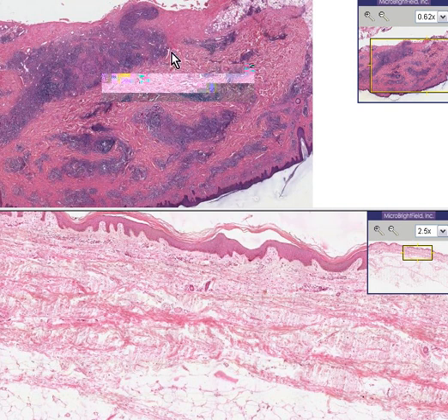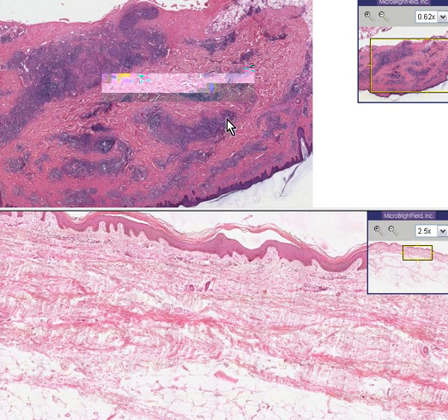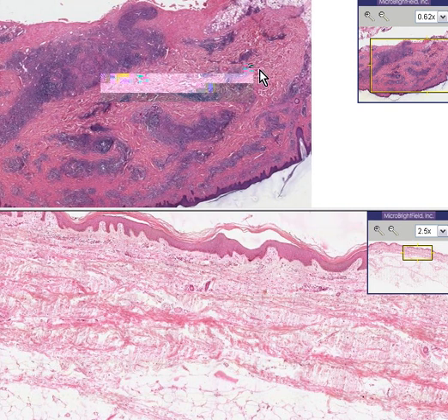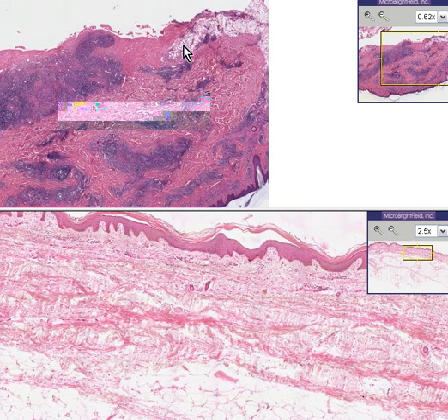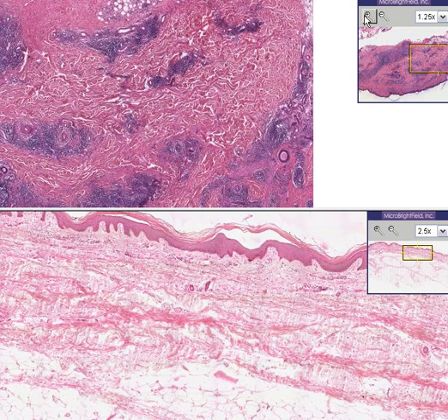But the reticular dermis is very thick and infiltrated with these bluer areas. And there is a little bit of subcutaneous fat here as well.